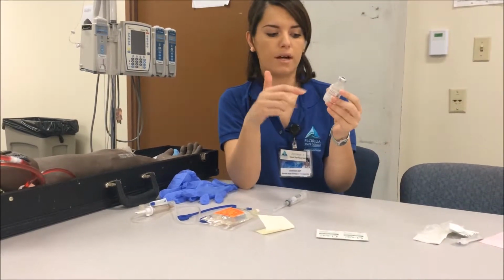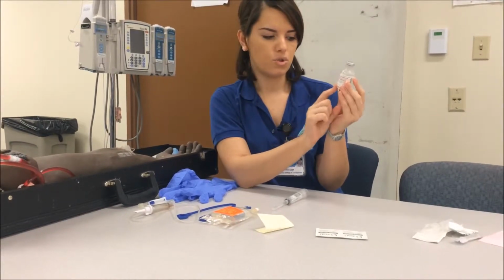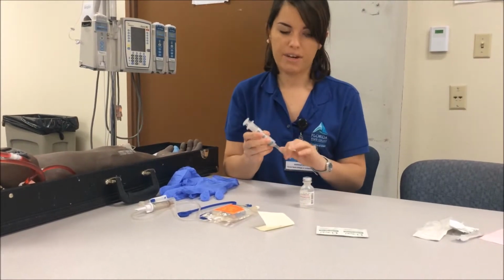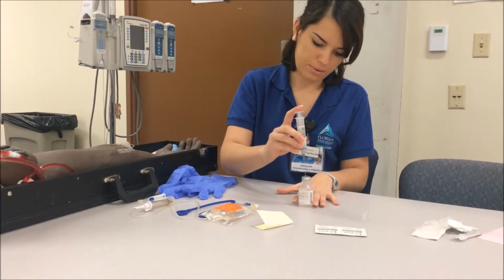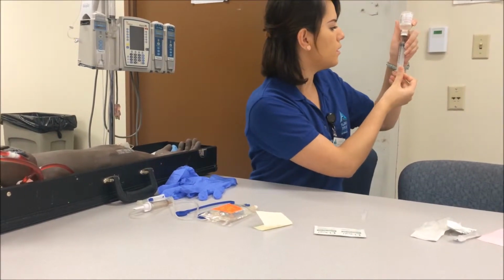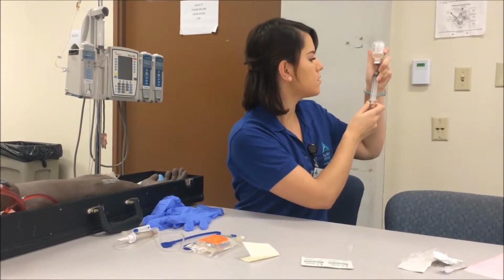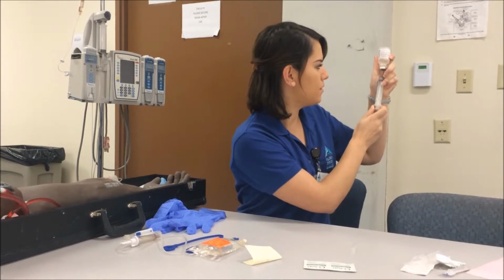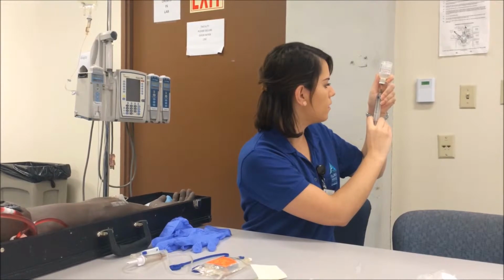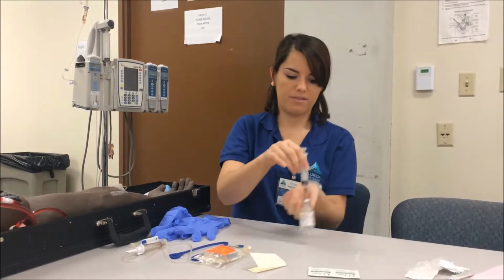And before I get my medication out, I'm going to make sure to look at my drug and make sure that it's up to date and has not been tampered with, and it looks great. Once again, I already have cleaned it, so I'll go ahead and infuse my air in there and take out 0.3 milliliters, and try to avoid any air bubbles at all costs. Try to flick them out if there are any that may have formed.